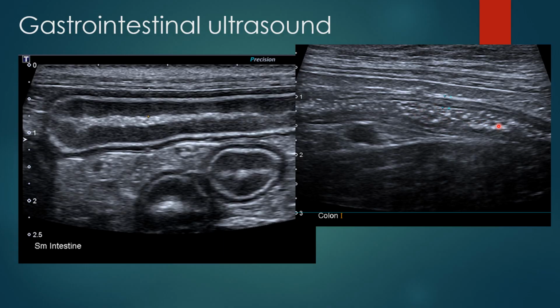That's why it has these hyperechoic speckles, but it also has some hypoechogenicity to it as well, which is kind of fluidy fecal content. This is the more superficial wall from the caliper marker here to here. And in the colon, you may not get nice distinct layering like you will see in the small intestine. It's just because the wall is a lot thinner and it's a little bit harder to resolve those layers, but they are there.